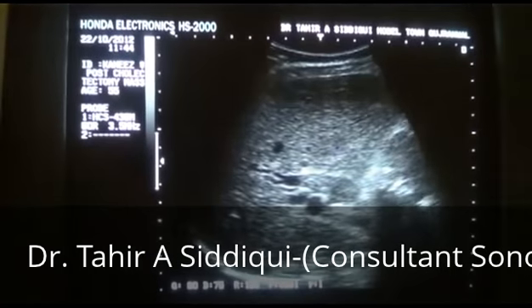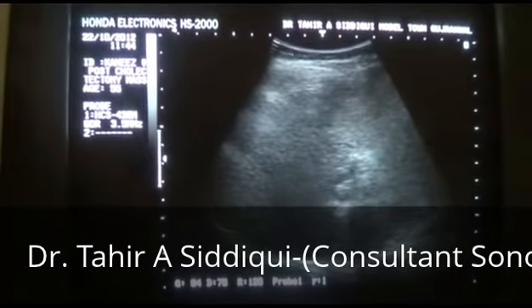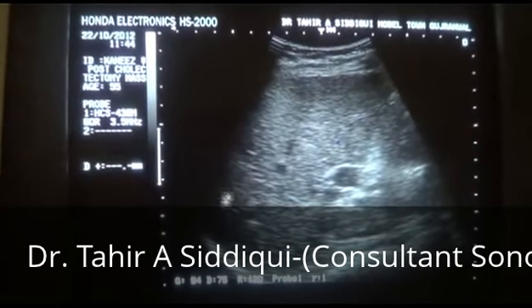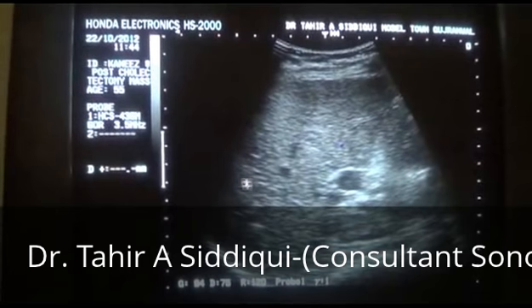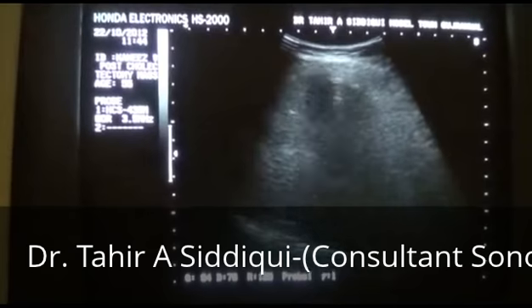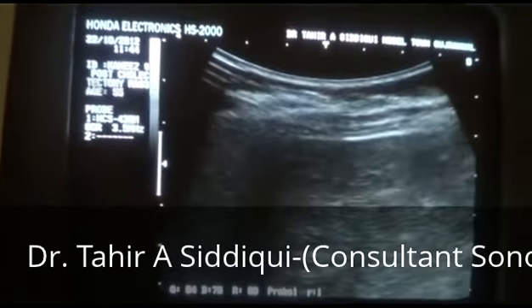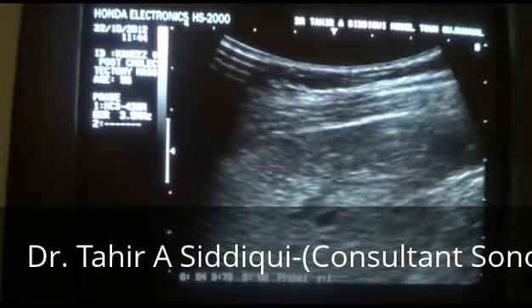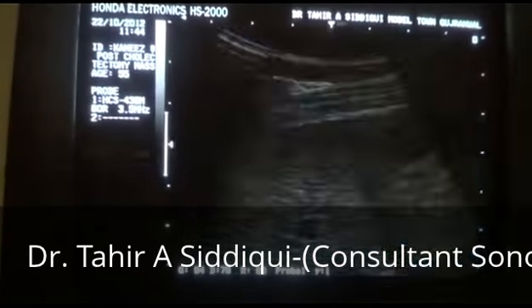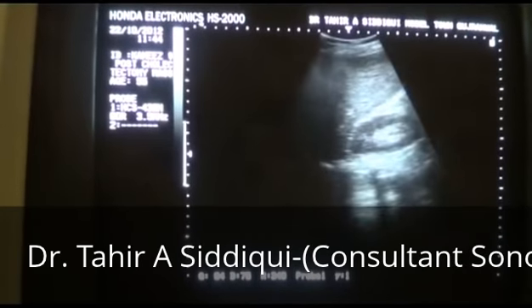The liver shows early cirrhotic changes. As you can see, this area shows diffuse increased parenchymal echogenicity, and the outer surface of the liver does not show significant irregularity. So these are the early liver parenchymal changes.